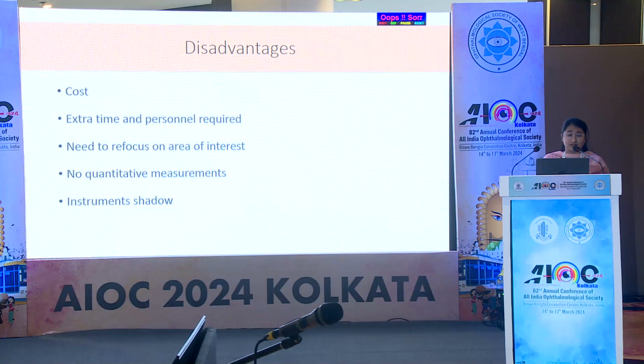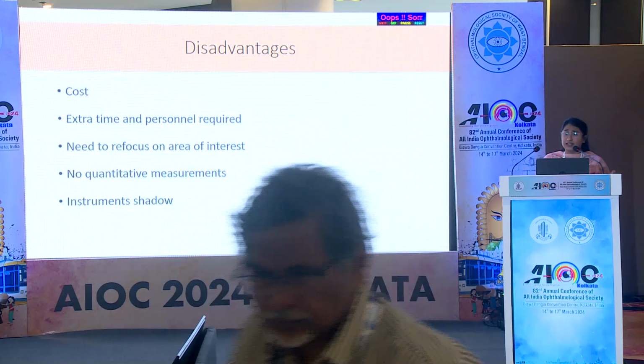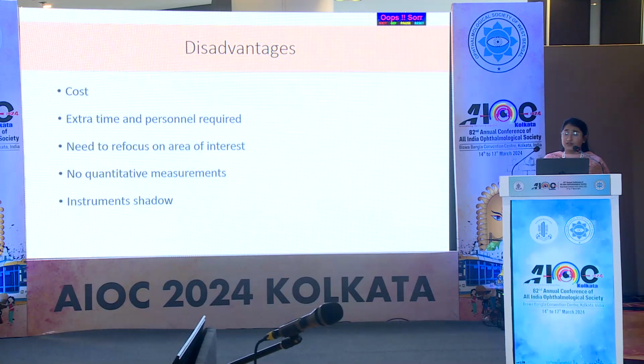But there are disadvantages to this. The cost, the extra time and personnel required, we need to refocus on an area of interest. There are no quantitative measurements to identify the amount of drug we inject for the subretinal or submacular hemorrhage, and the instruments do cause a shadow.